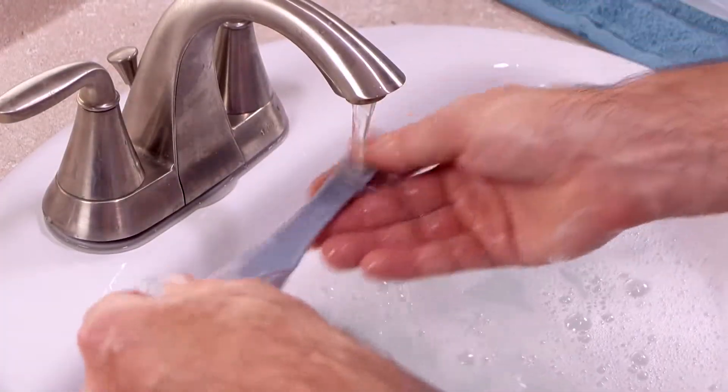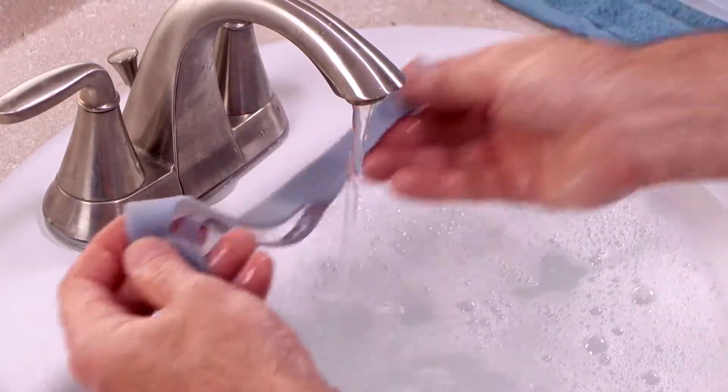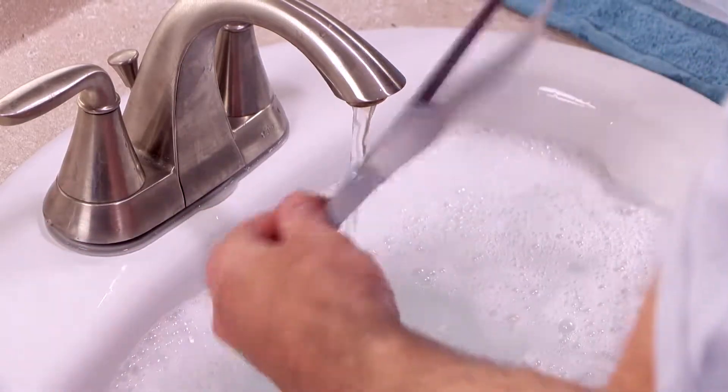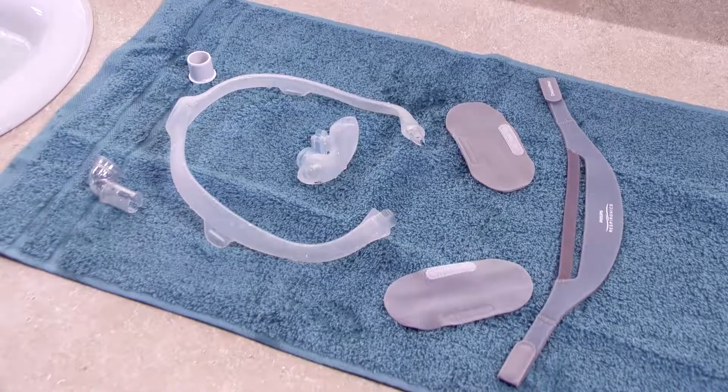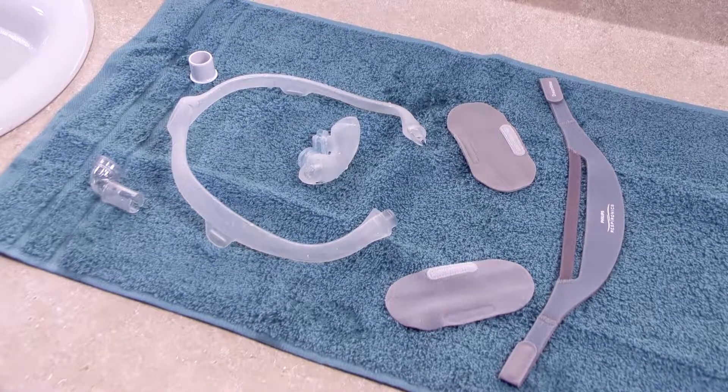The fabric headgear and sleeves should be hand washed weekly with mild dishwashing detergent. Spread the clean, wet fabric parts out flat or hang them on a line to dry. Do not place them into the clothes dryer.